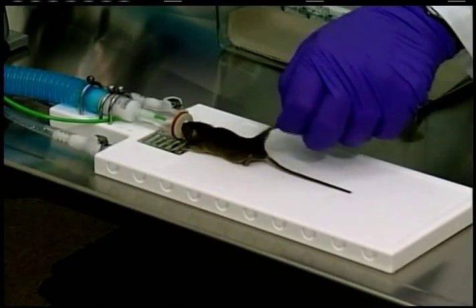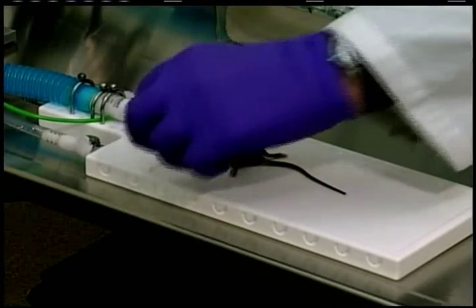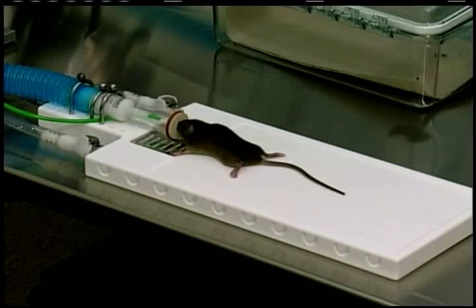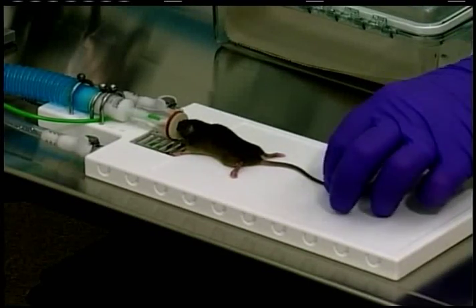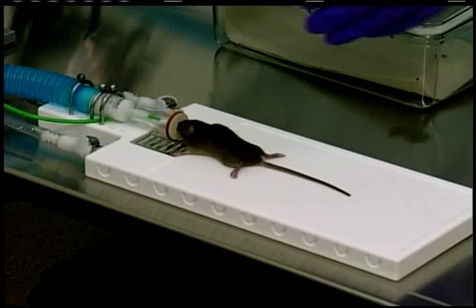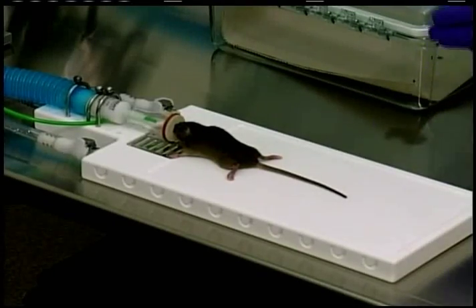I can see that he's not responding to the toe pinch reflex. And he has a nice pink color, and he looks pretty good here. So I'm going to turn him down to that 2.5% level. And if you wish, you could restrain the animal using little tie downs. You could prep the animal here if you wanted, and do your surgical procedure on the animal.